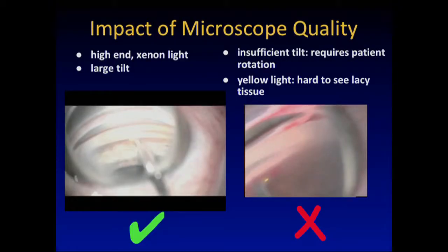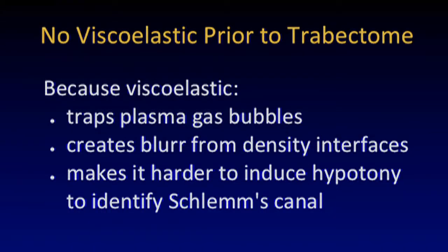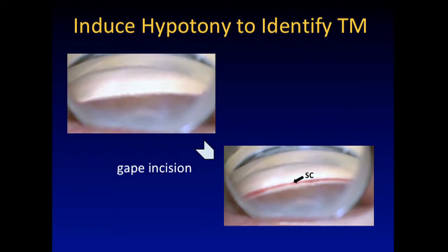Xenon is a more bluish light and it allows you to see a lacy structure that is semi-translucent. Don't use viscoelastic — those with experience from first generation packages have used it, but you're trapping bubbles, trapping blood, and you will not see. I will show you how to induce hypotony to identify the structure, because this is perhaps the most common cause of trabectome failure. Not doing trabecular meshwork ablation — instead ablating the ciliary body. That brown structure in the angle you thought was the meshwork is actually a highly arterial structure. Lots of bleeding, high pressure, and you will never do this procedure again.